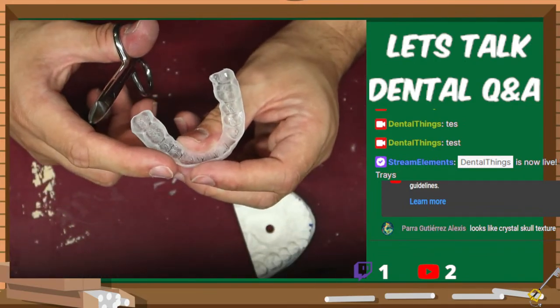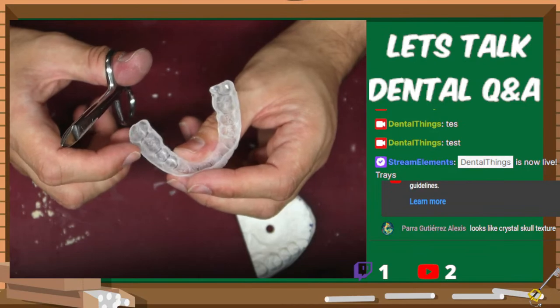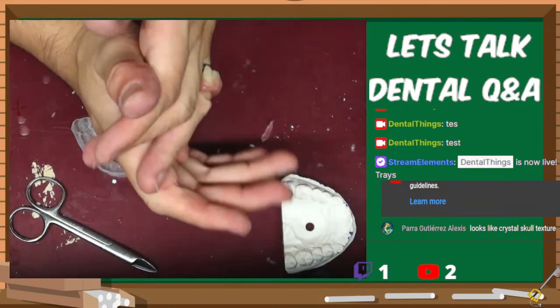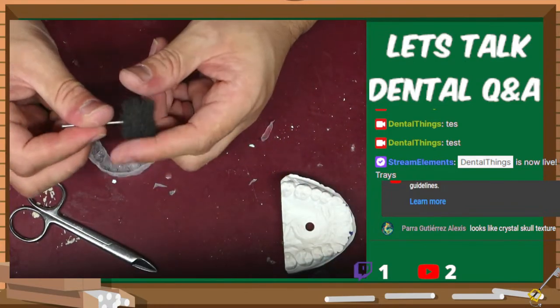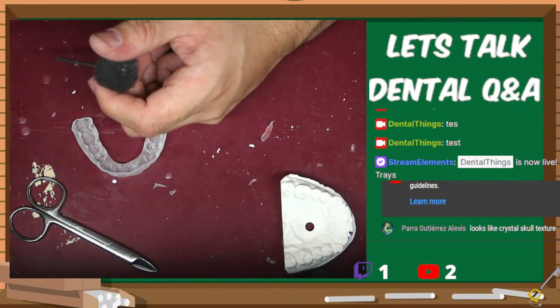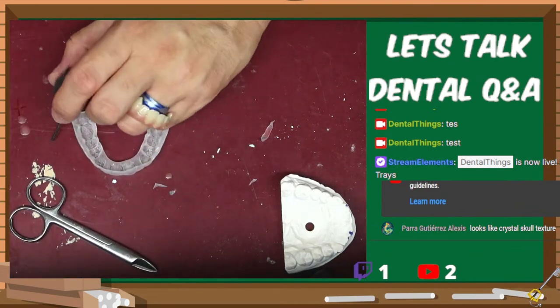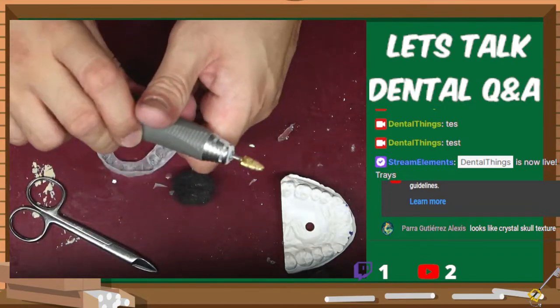But a lot of the edges on these have a rough feel. And so I'm going to go and deburr or take off that little rough edge with some polishers or with a wheel that's going to take off the rough edges for me. So with that, I switch to another one of my tools. I don't need my wax pot right now, but I do need my laboratory handpiece.